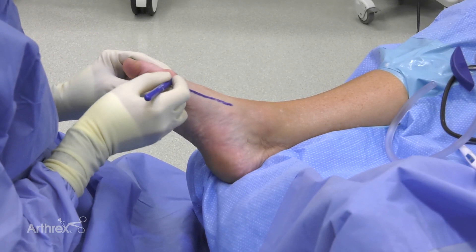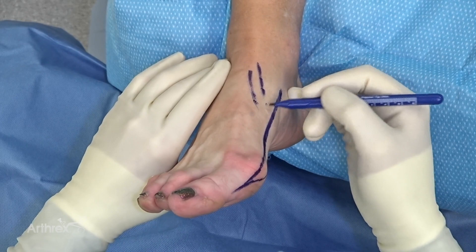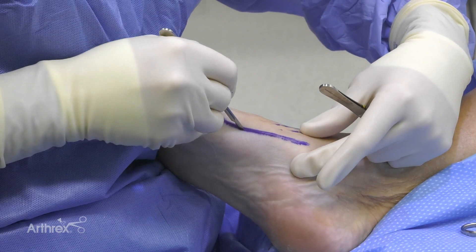Down around this area, if there's a large knot on the medial side, sometimes I'll take a little bit of the skin out, as it often is quite redundant here after the correction. So again, looking at our tibialis anterior tendon coming down in this region. We're ready to make our incision.